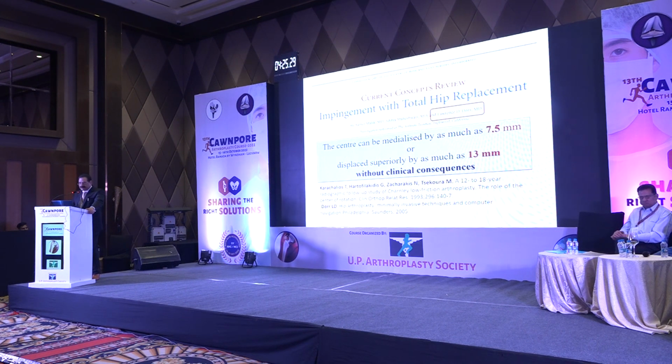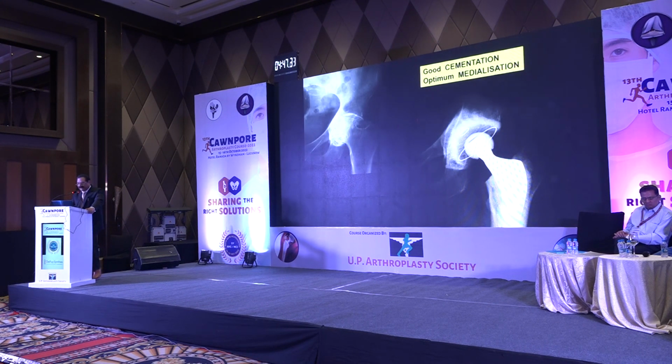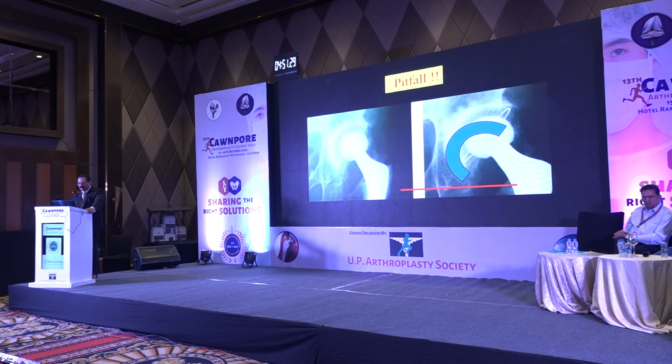Now, the cup can be medialized, but should never be lateralized. This is a sin. Here, the cup is up and out, and is going to fail very early. The surgeon has not removed osteophytes from the floor, and similarly here, it is lateralized, so they are going to fail early. Dr. Beatty showed a lot of cases of good cementation and optimum medialization, but in this case the cup is higher and out, which is a pitfall.